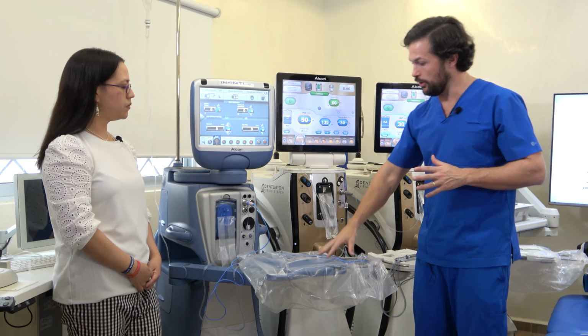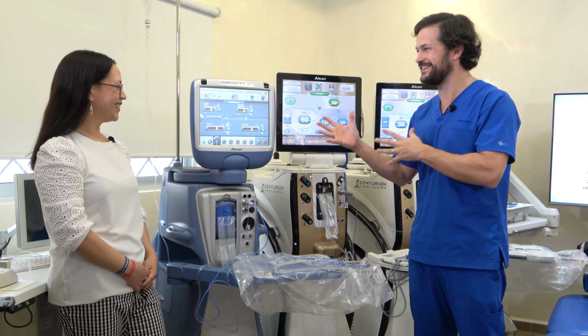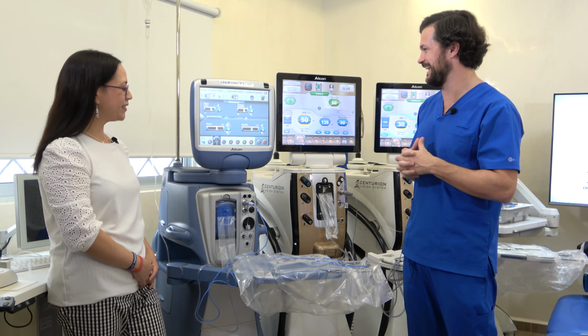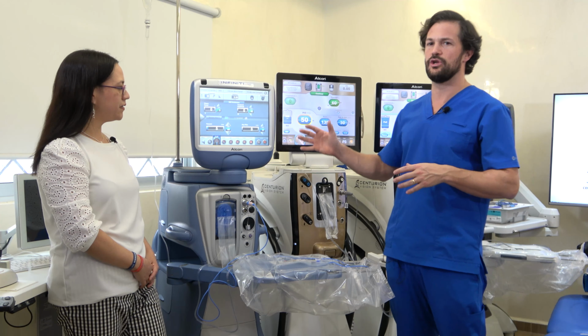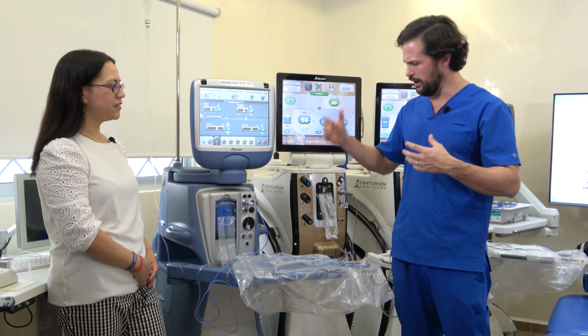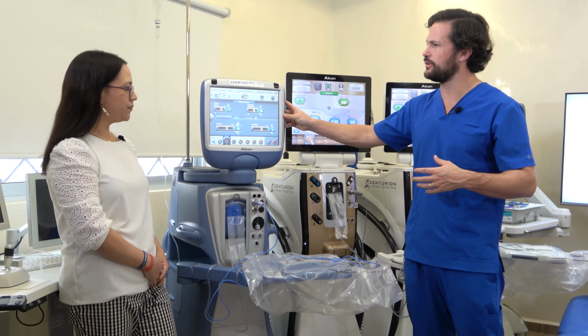machines. So the first thing is, it looks kind of old, but I did my fellowship with it, so it's not that old, or at least I like to think that. But something very important happened. This machine was very efficient, very controlled, but had a huge impact in ultrasound, more specifically with the OZil ultrasound. It was the first time we launched OZil ultrasound.